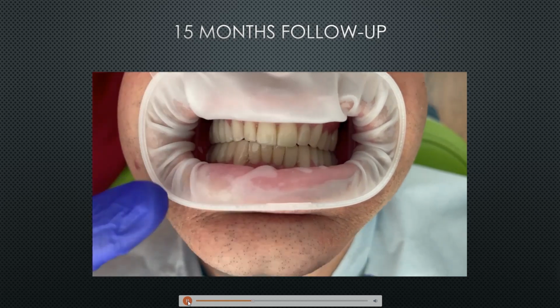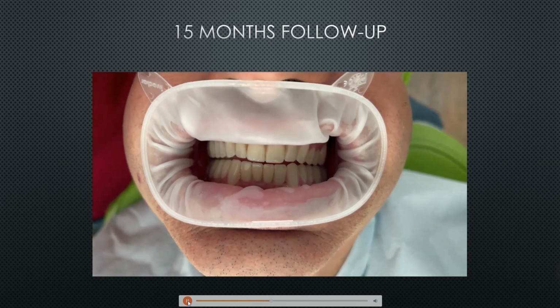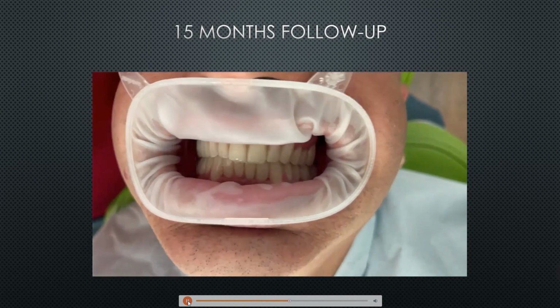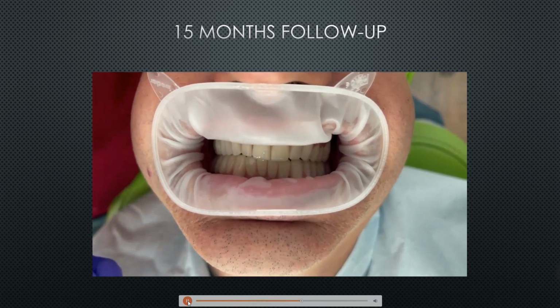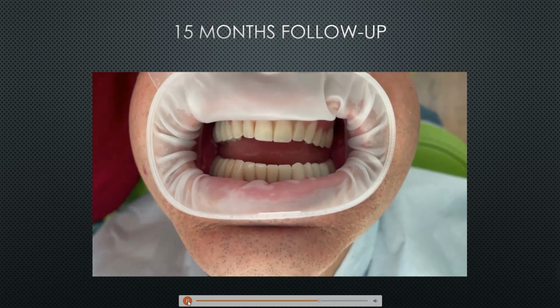So this, I think a year and a couple of months we have done it, except for this root canal. You don't have anything else in your teeth. Okay. No open margin. Even after 1 year, all the margins are closed. Subgingival.